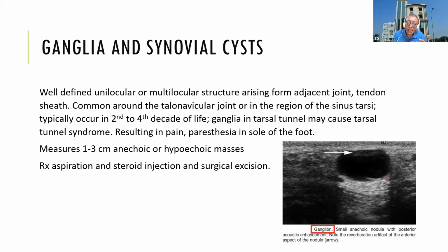But if this ganglia is located in a specific site, such as the tarsal tunnel, then it can cause pressure on the posterior tibial nerve and can cause tarsal tunnel syndrome. And in these conditions, we have to take active intervention.